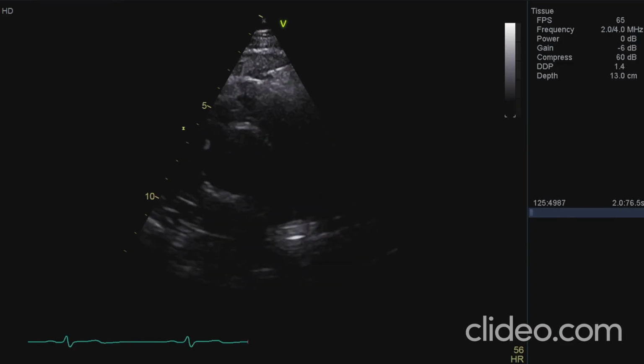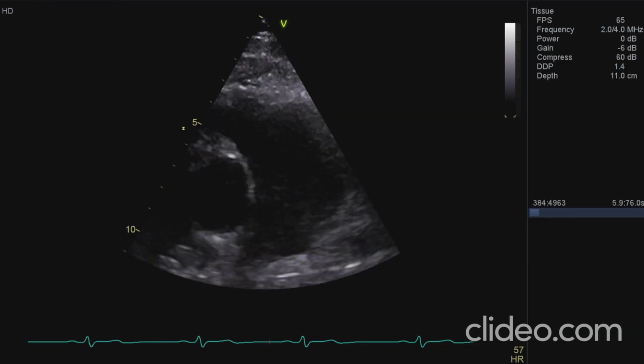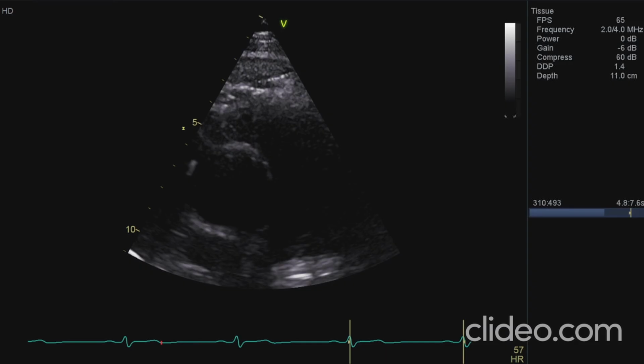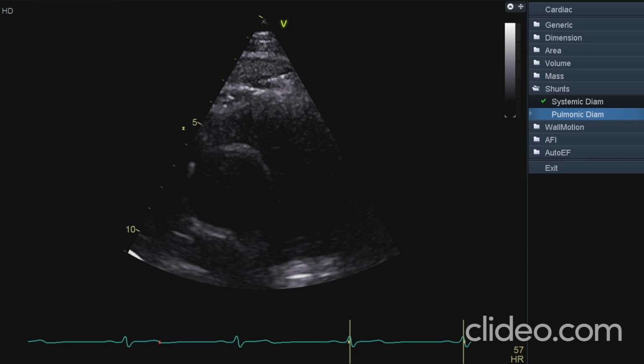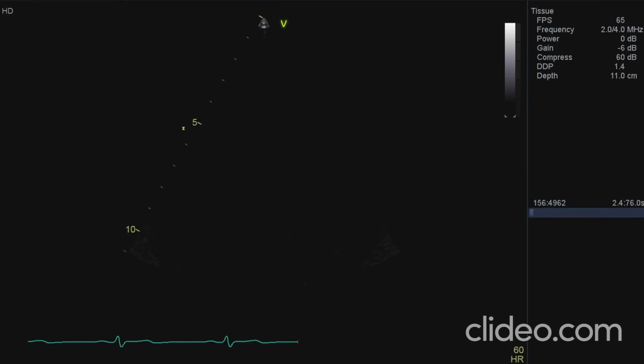So I'm going to do this in systole again. Probably going to focus quite carefully on this. So you see I was very careful checking the cycle that I got the walls best. Go back to my calculations package, it will tell me what to do. I'm going to measure this diameter about here and put that into the memory. I now want the Doppler waveforms to go with those.